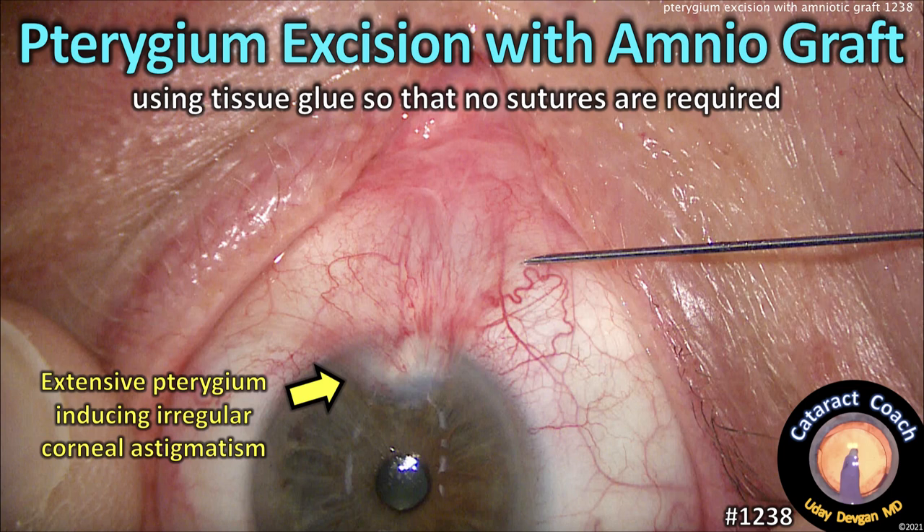CataractCoach.com — pterygium excision with amniotic graft, and we'll use tissue glue so that no sutures are required.